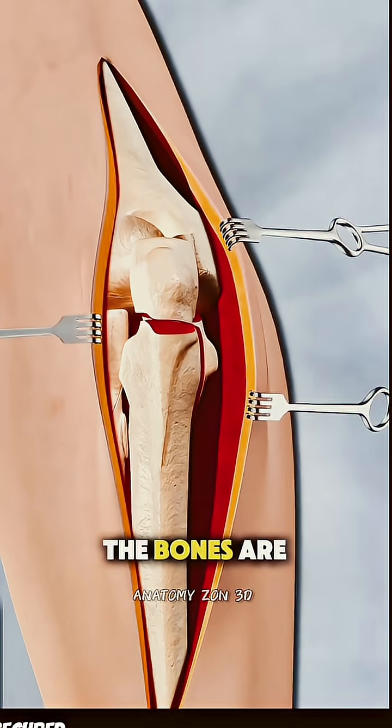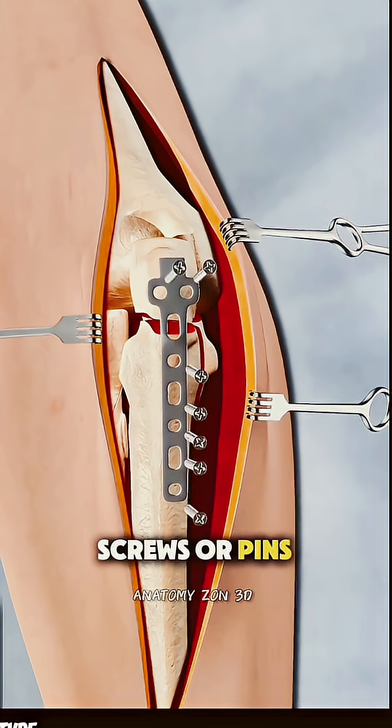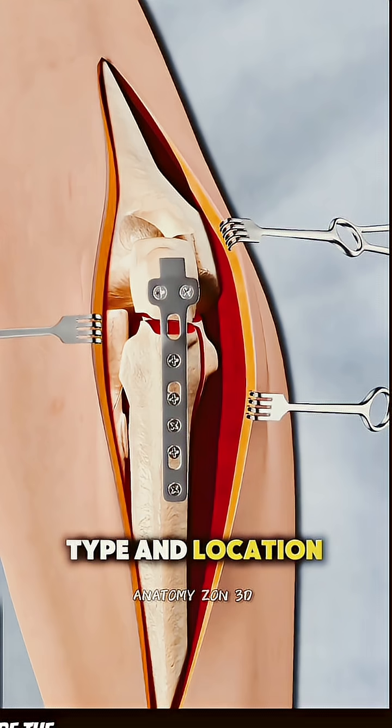Once aligned, the bones are secured using metal hardware, like plates, screws, or pins, depending on the type and location of the fracture.